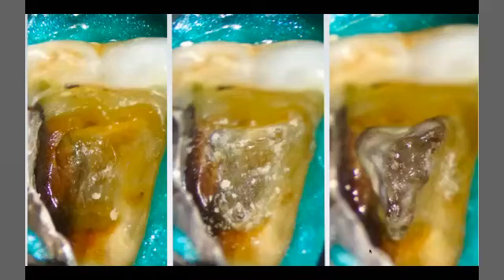You can see in this slide, the first image on the left is the situation before starting. Then after some roughing with ultrasonic tips, still I have bright dentin, and at the end we have dark dentin, and we are now reaching our pulp floor: mesiobuccal 1, mesiobuccal 2, distobuccal, palatal. Now I don't have any problem. I can negotiate the root canals. They are narrow but not calcified, because here the calcification doesn't go inside the root canal.